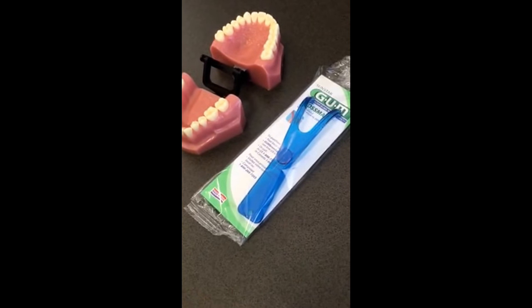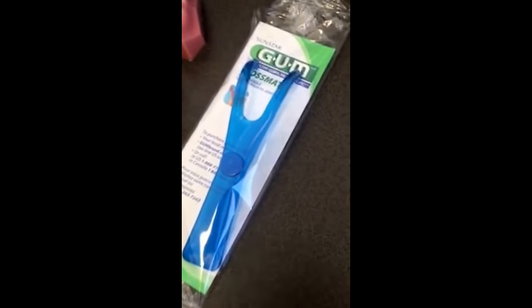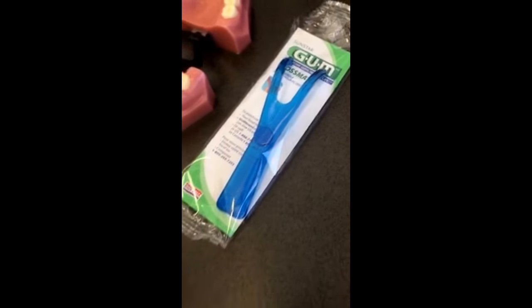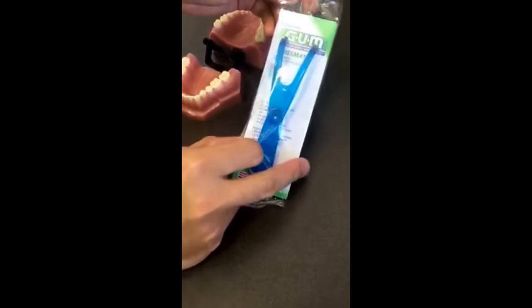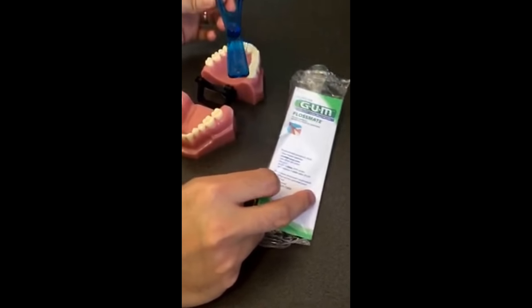Hi there and welcome to Gateway Dental Health. Today we'll be showing you a great tool for flossing, the Gum Flossmate. Used correctly, this can save you both time and will make flossing a much easier part of your daily routine.